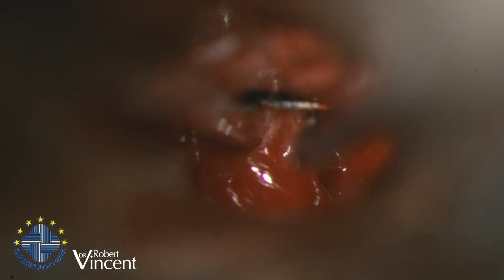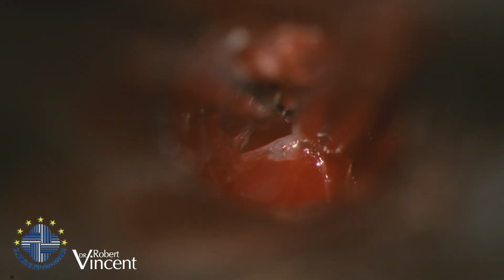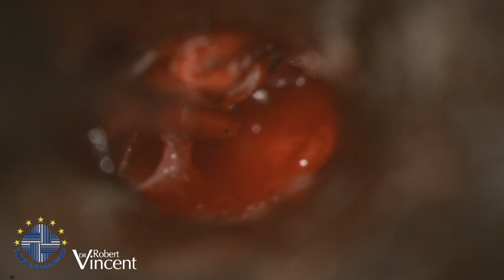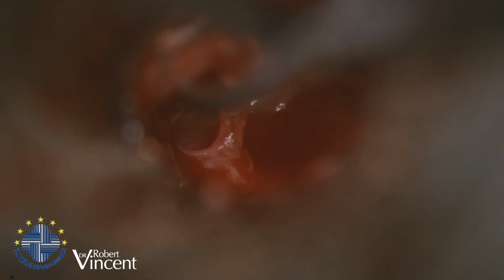Okay, ciseaux. Okay, can remove it now. Pince, s'il vous plaît. Second one. Collection of prostheses there. Both are the same. Both are not working. Calmez, s'il vous plaît. So now, of course, I may have to place a malleus prosthesis, we'll see.